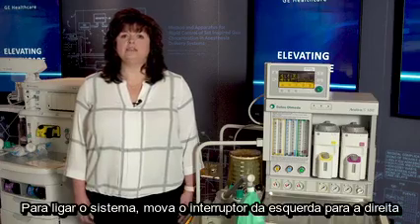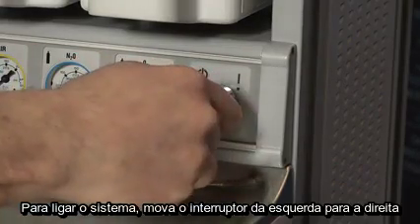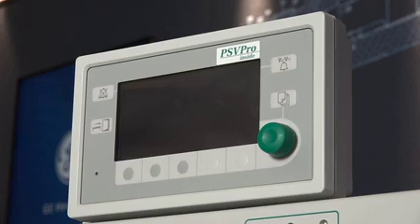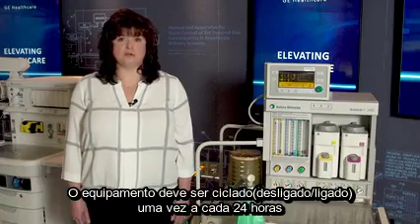To turn on the system, move the switch from left to right to power on. The machine may take up to 15 seconds for the display screen to turn on. Power should be cycled once every 24 hours.